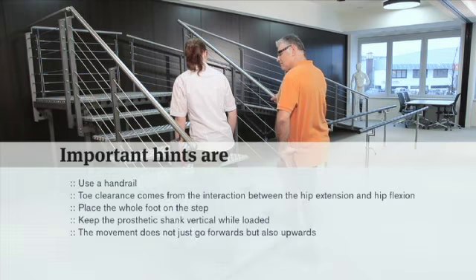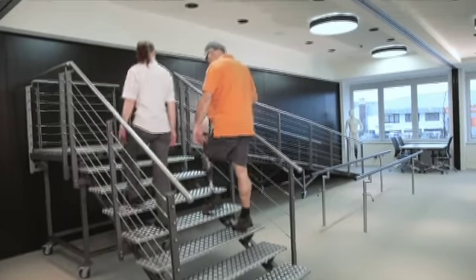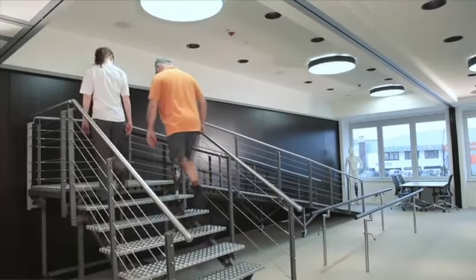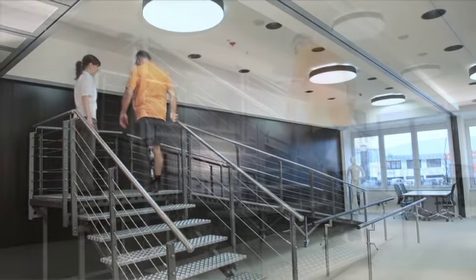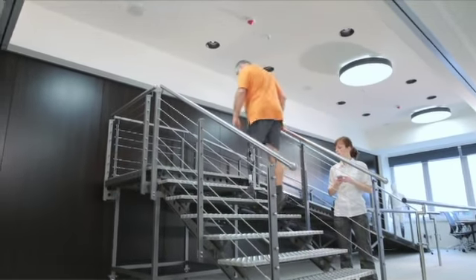Toe clearance does not come from the hip extension movement, but from the interaction between the hip extension and hip flexion movements. Place the whole foot on the step. Keep the prosthetic shank vertical while loaded on the step. The movement does not just go forwards, but also upwards, so that the upper body and the pelvis are moving in that direction while extending the hip. This movement can be initiated whether the user is standing still or walking.